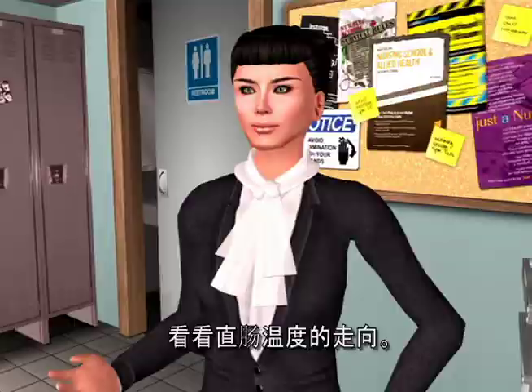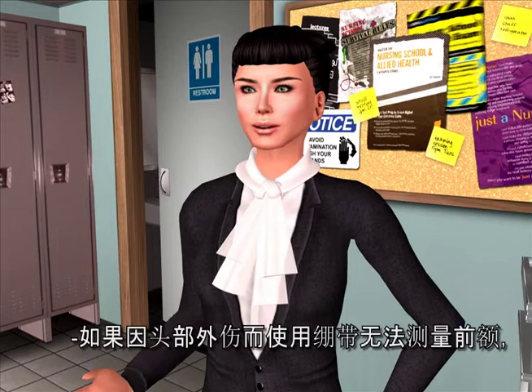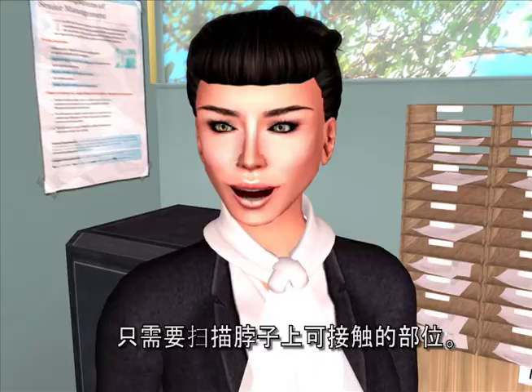If the forehead is inaccessible because of bandages due to head trauma — remember, vasodilation in the neck is assured with both diaphoresis and head trauma, whether from a surgeon's scalpel or a Mack truck — just touch the neck behind the earlobe, press and release the button. If behind the earlobe is covered with pressure dressings, just scan the part of the neck that's accessible.